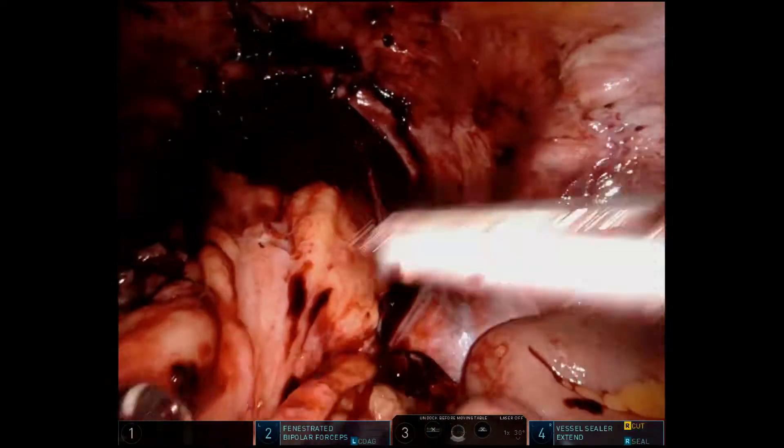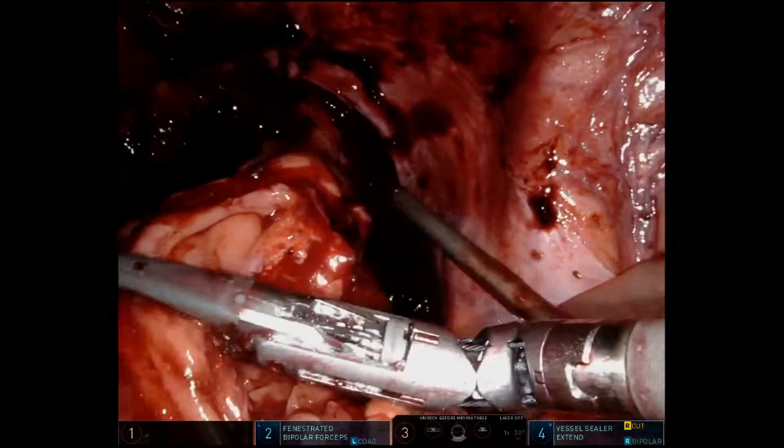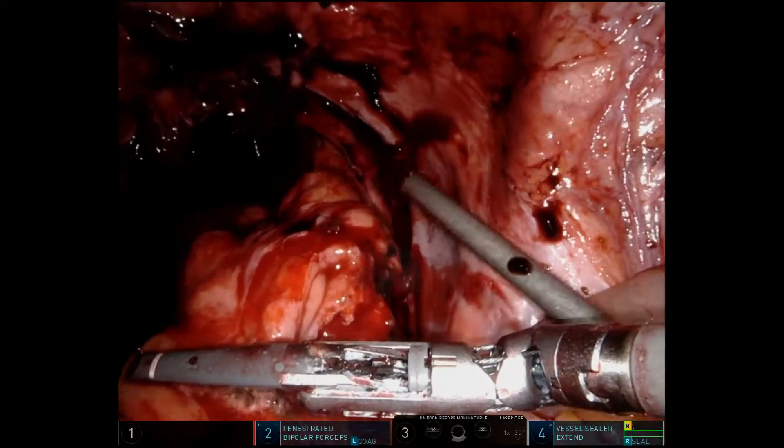Now we're down to our distal level of transection. We're dividing across the rectum — this is closer to the midrectum — with a nice, smooth division using the vessel seal extend.